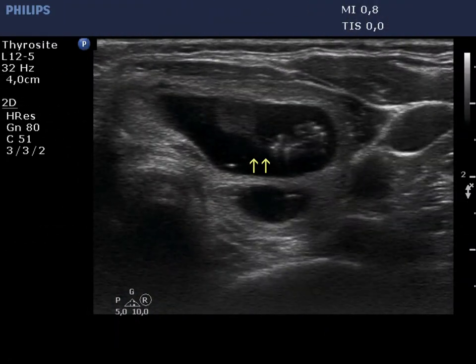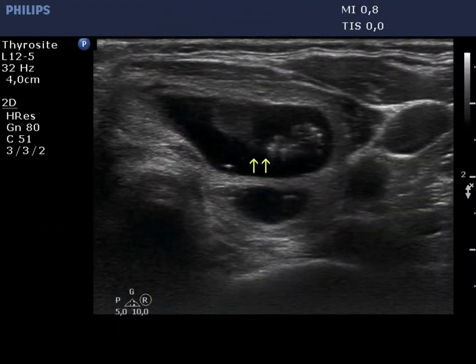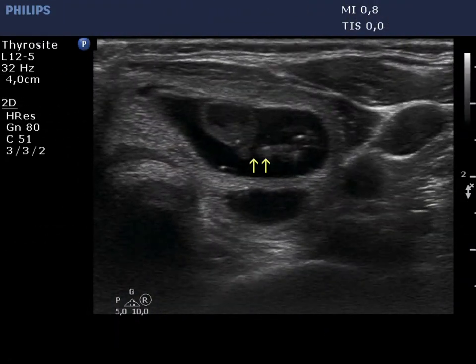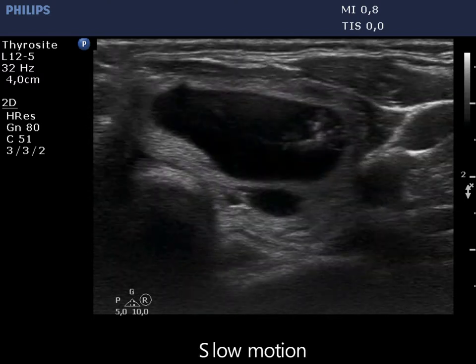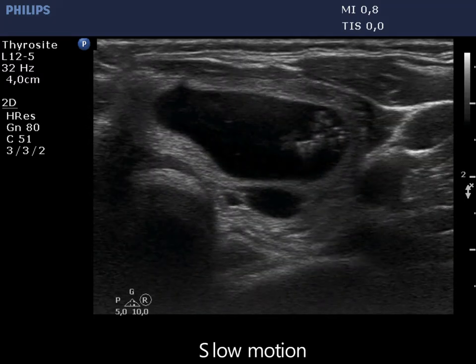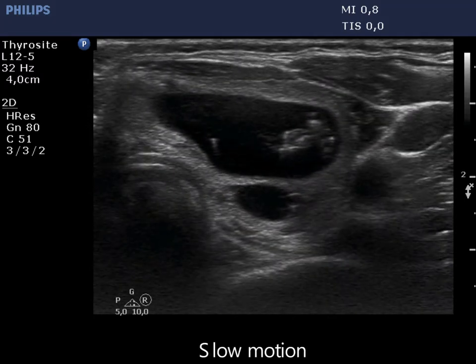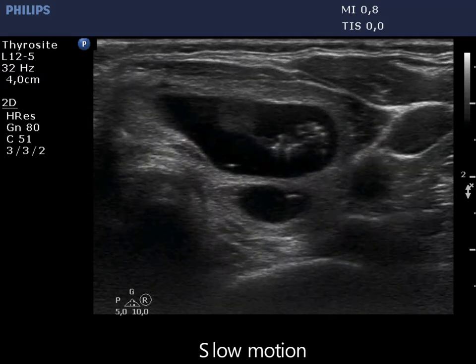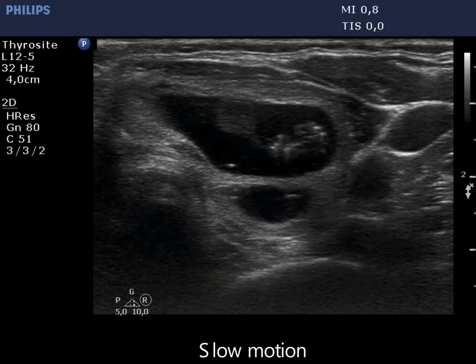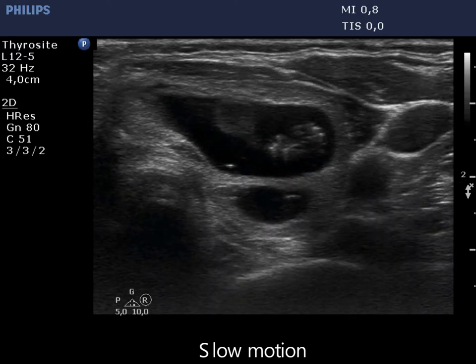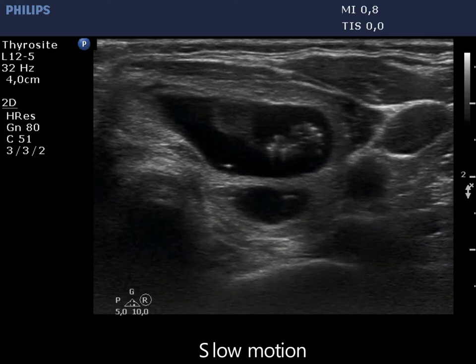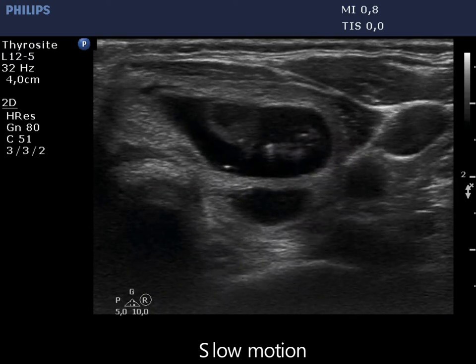It is worth analyzing the video before we start with the second phase of aspiration. The moving structure marked with yellow arrows proves that the lesion has started refilling at once.